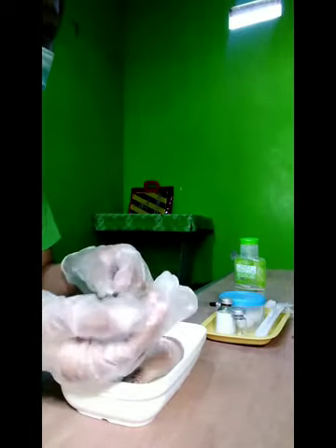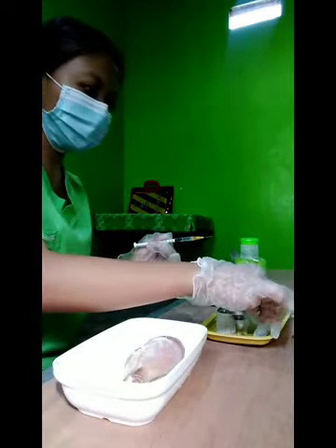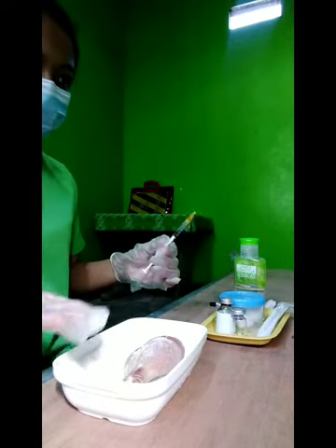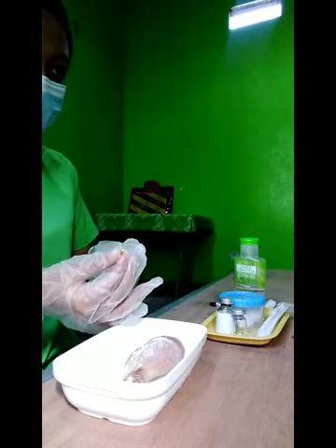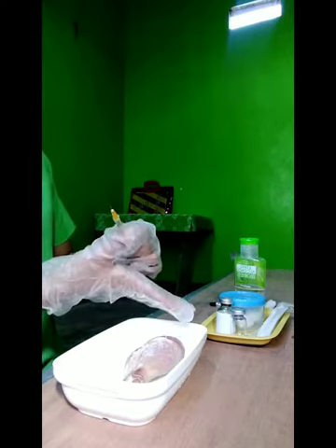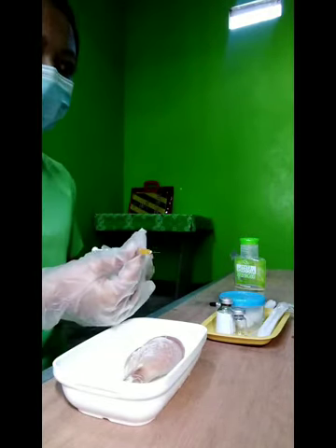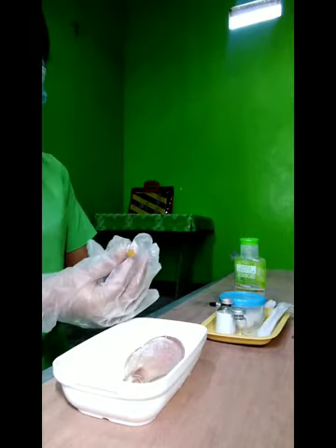Remove the needle cap with the non-dominant hand by pulling it straight off. Hold the syringe in the dominant hand between the thumb and forefinger with the bevel of the needle up.